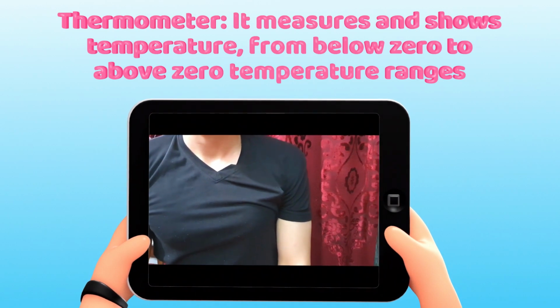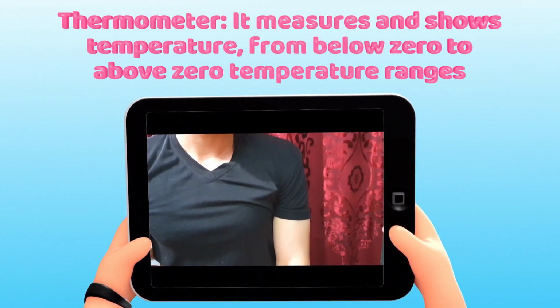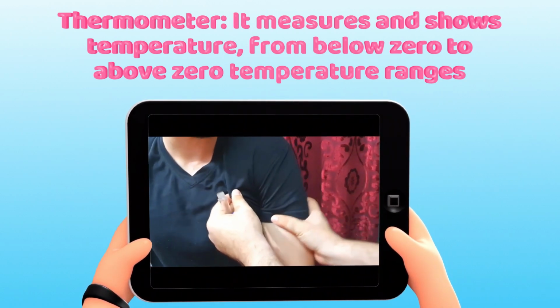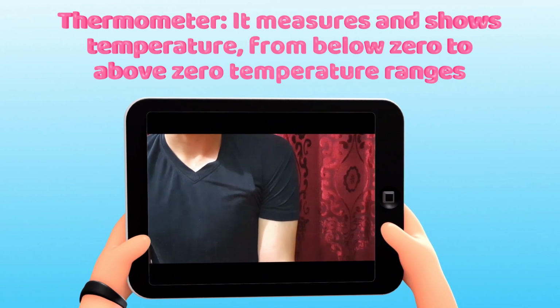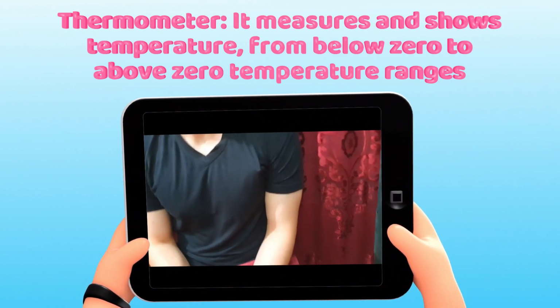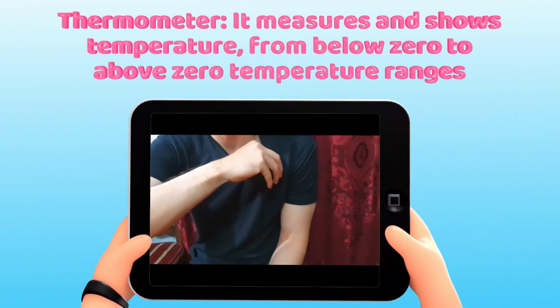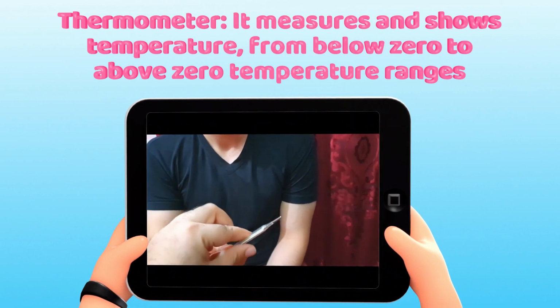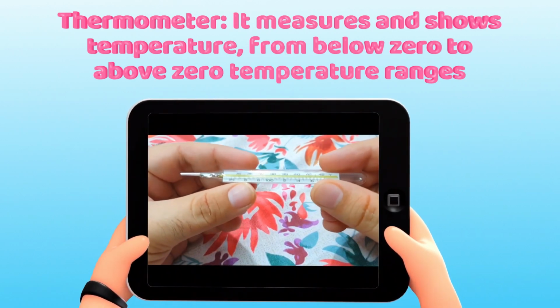So when we are measuring the temperature maybe of a person, you need to take the thermometer and put it under the armpit of someone. Then you can leave it there for maybe 2 minutes, and then you can take it back. After taking it back, you can check the temperature range.